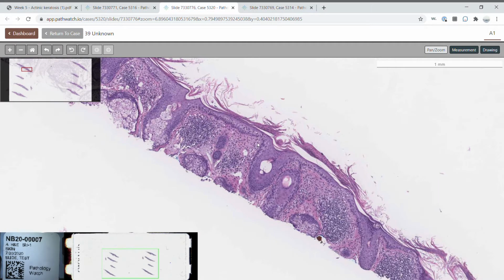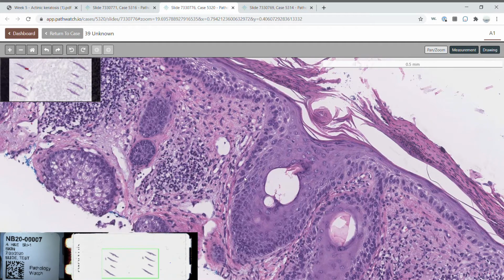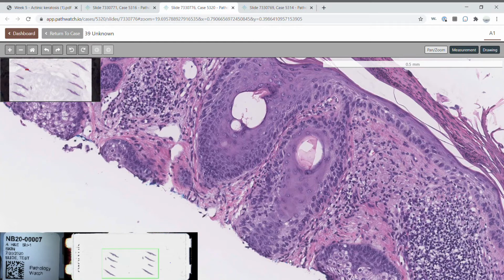Sometimes, though, the follicular infundibulum is not spared, as seen in this case, with the basal keratinocytic atypia extending down the follicular infundibulum. It's present at the base of this biopsy, which signifies an increased risk of recurrence following biopsy.